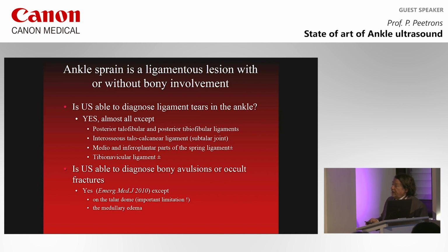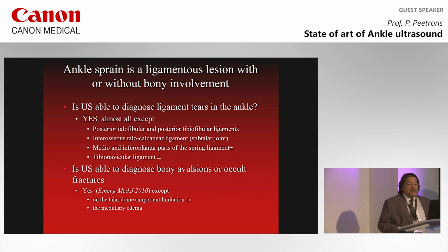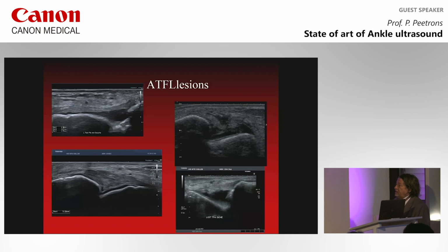So is ultrasound able to diagnose bony avulsions or fracture? Yes, this has been shown in another paper from the Emergency Medicine Journal, except for the talar dome, and this is the most important limitation of ultrasound and the most important thing that you have to think about when an ankle sprain doesn't heal and is still painful 3, 4, 6 weeks after the injury. So always think that we cannot see this, and this can be very important to have a diagnosis of this, and you must go to MRI in these cases.